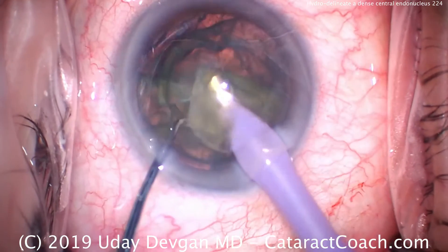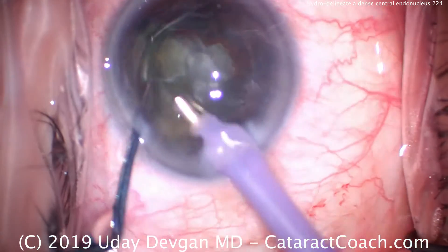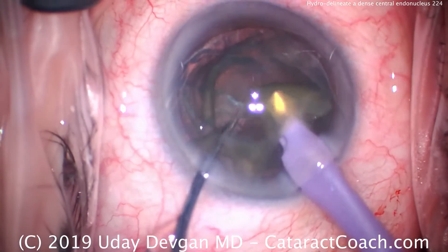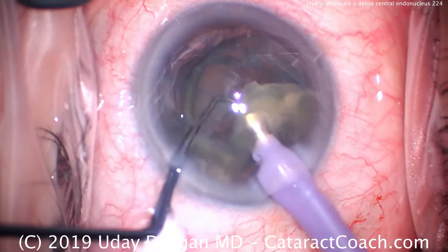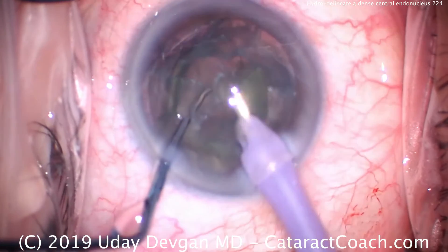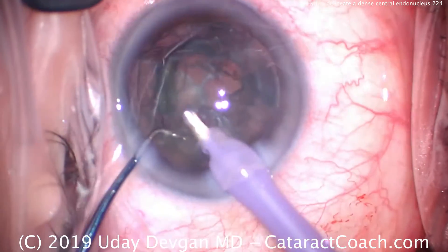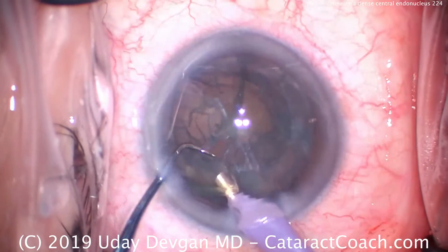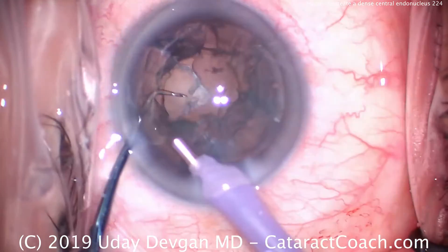About half the nucleus has been removed. We'll go ahead and finish this and then phaco-aspirate the last piece. There's still a nice epinuclear shell keeping the posterior capsule back and giving us a barrier or cushion as we operate. We'll remove the last little bits of endonuclear pieces first, and then use the vacuum to aspirate out the epinuclear shell.